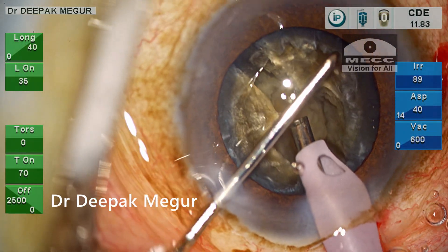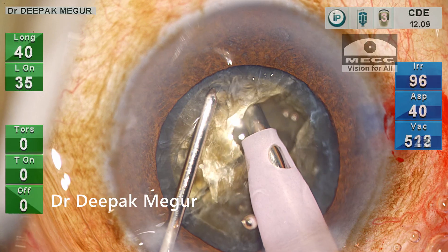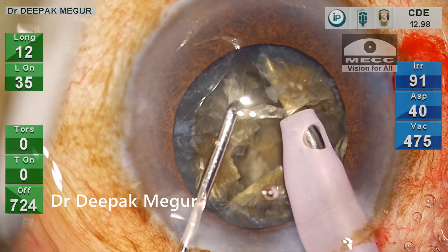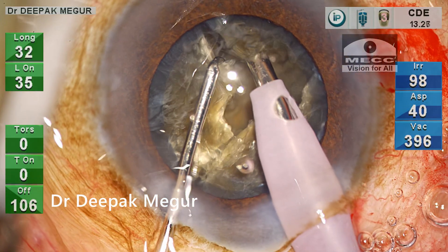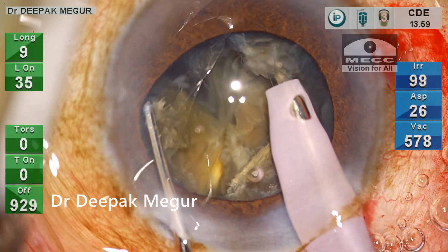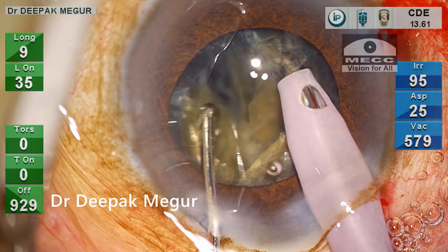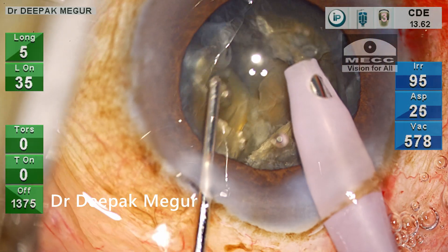No problem — I just rotate the nucleus and continue to chop. The chopping and lateral separation is done at progressively deeper planes; the posterior plate is quite tough, but with sustained effort it gets separated, though some part is still attached. I continue to chop the first hemi-nucleus vertically, being aware that during lateral separation I am sometimes stretching the rhexis margin.